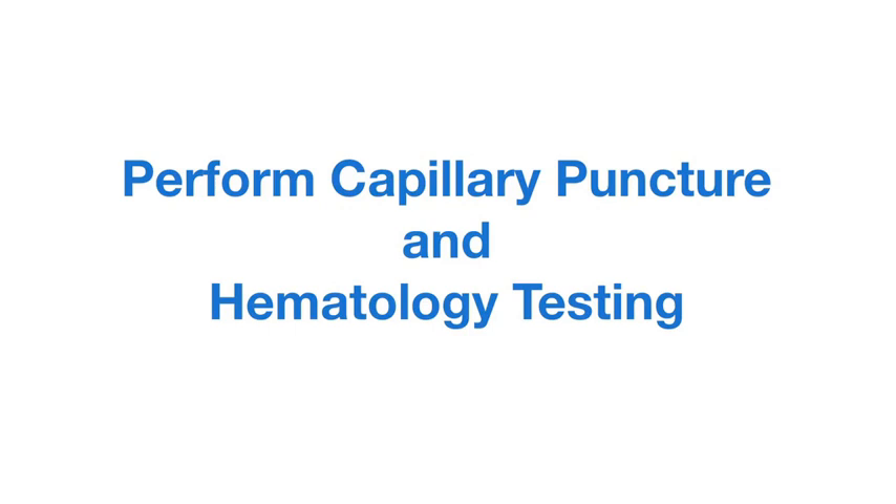This video demonstrates how to set up and perform capillary puncture and hematology testing.